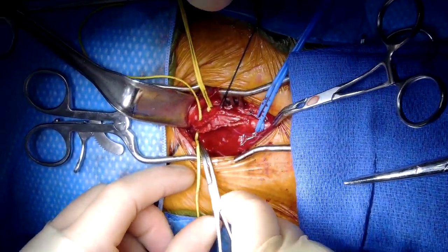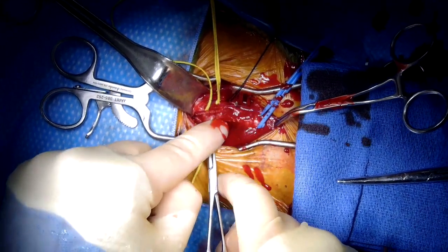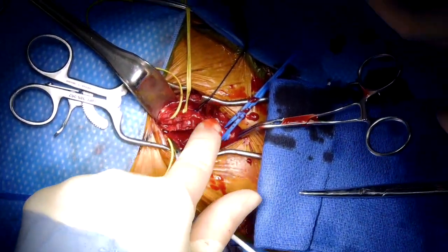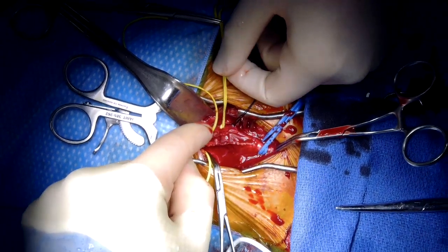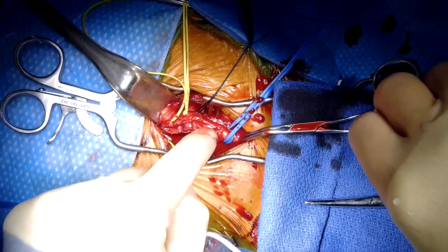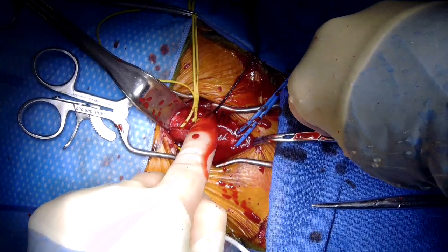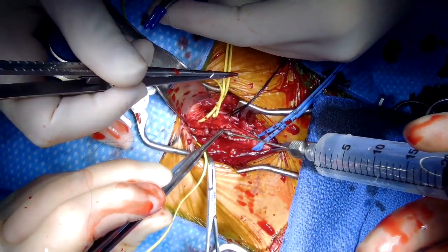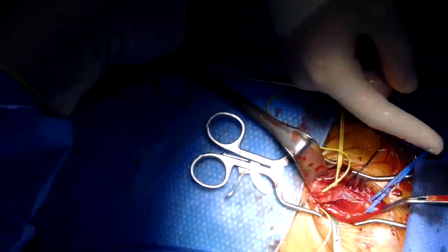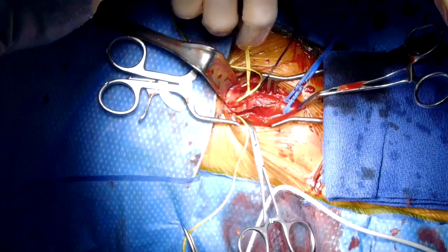The internal and external carotid arteries were back bled, and the common carotid was forward bled. The lumen was again irrigated with heparinized saline. The anastomosis was completed by tying the inferior and superior sutures at the midpoint on each side.